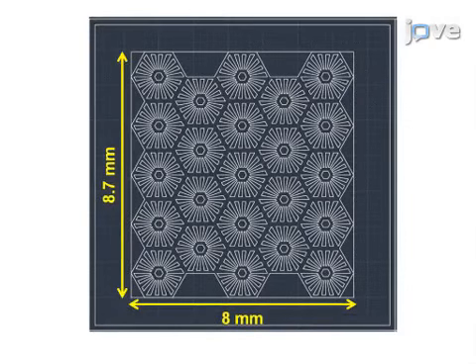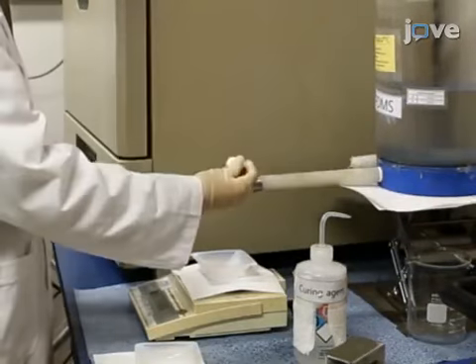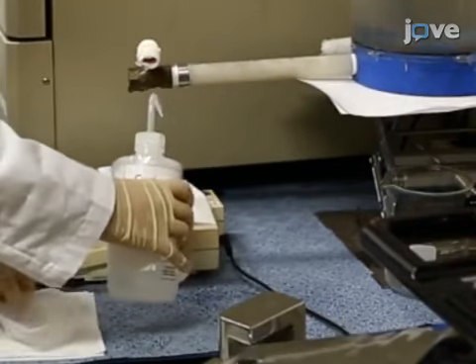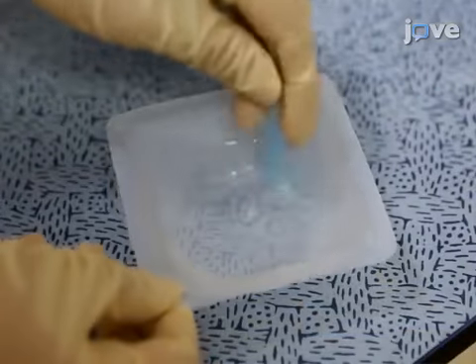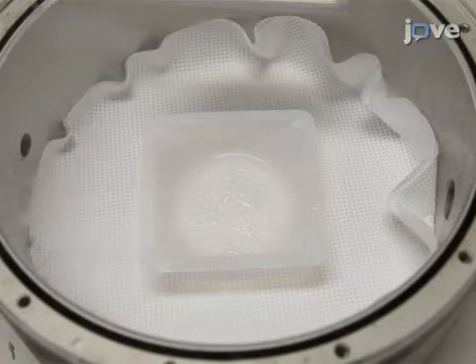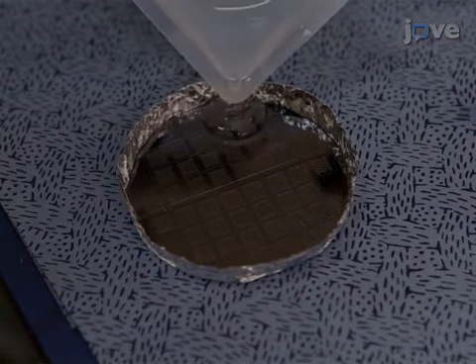The example shown in this video will use a liver lobule-like mesh pattern, like the one shown here. Next, weigh out 12.5 grams of PDMS and 2.5 grams of the curing agent solution, and mix the components together thoroughly. De-gas the solution in a vacuum chamber, and then spread the mixed solution onto the micro-pattern surface.